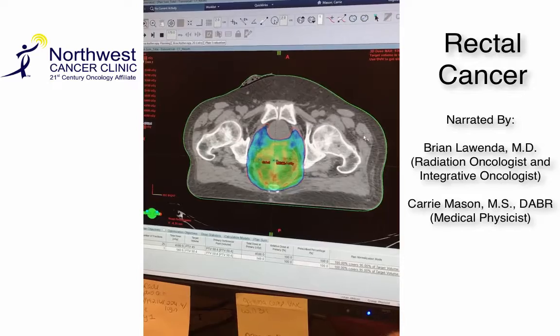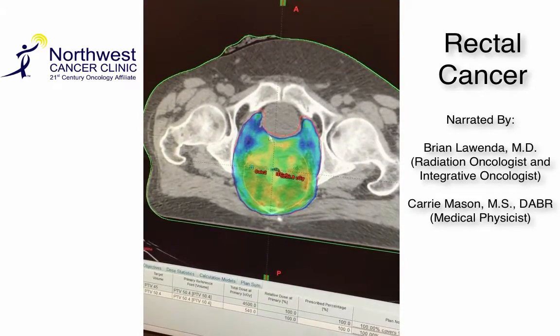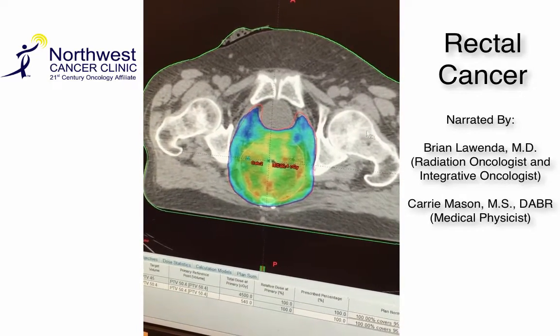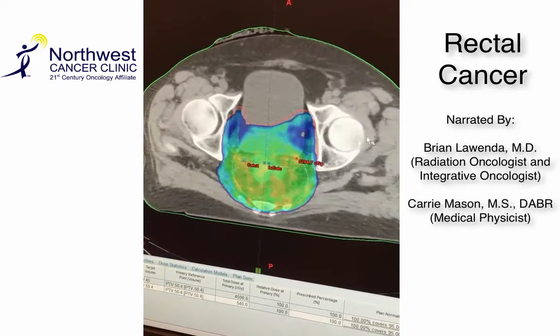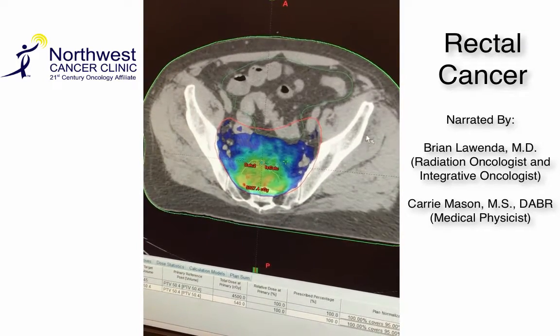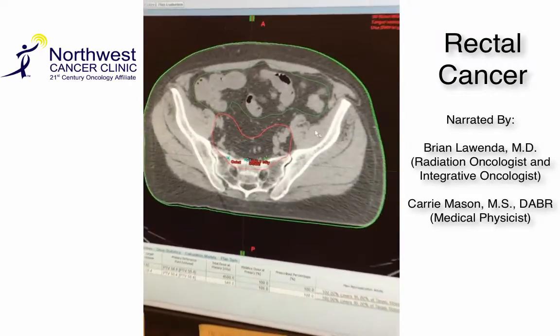You can see we're carving out the bladder just in the front, so we're trying to prevent radiation to that. We're also trying to prevent radiation to the hips, and as we go further up, we'll be preventing radiation therapy to as much of the bowel as possible, which is the green structure we're carving out as well.